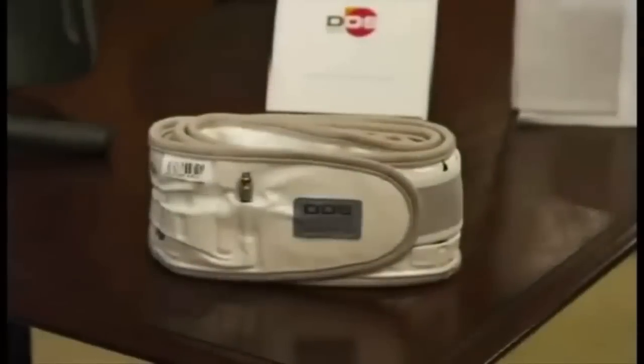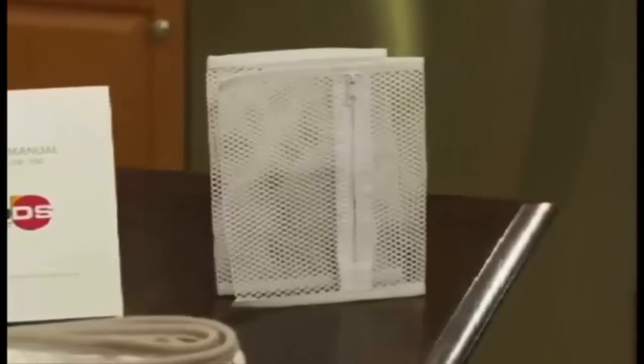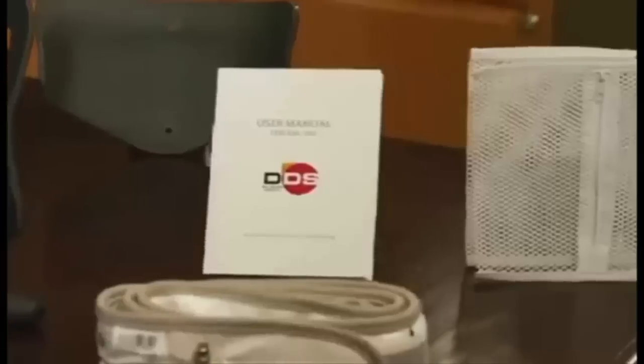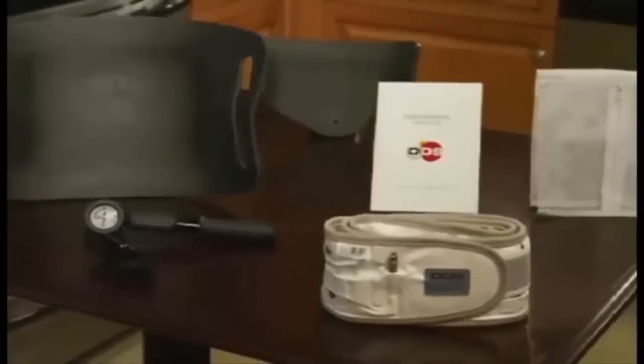Let's get started using your Back Traction Belt. When you get your Traction Belt package, you will find the lightweight Traction Belt, the easy-to-use hand air pump, a front and back panel, along with a reusable mesh laundry bag for easy washing, and an easy-to-use manual. Place all of the items on a table or counter for easy access.